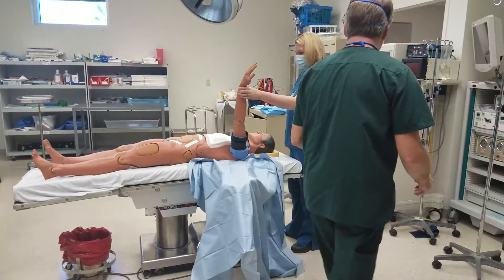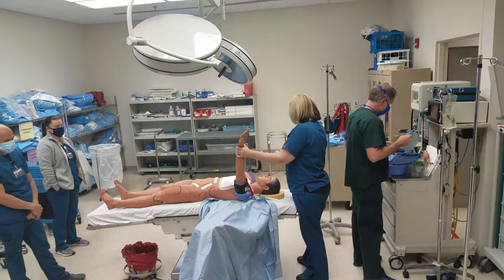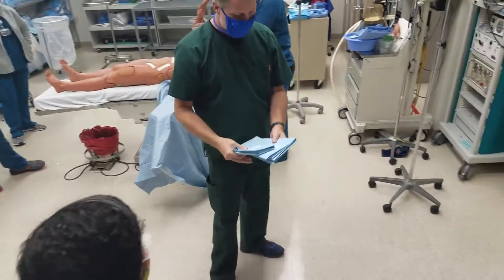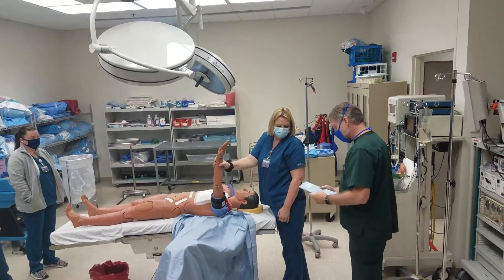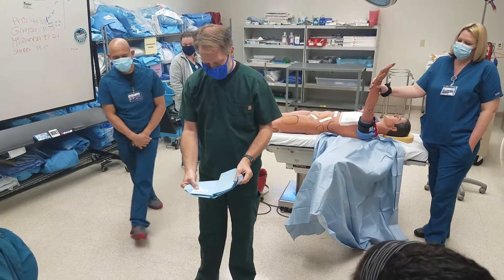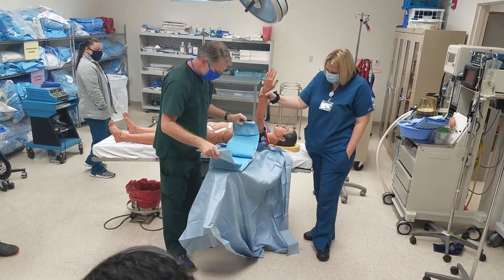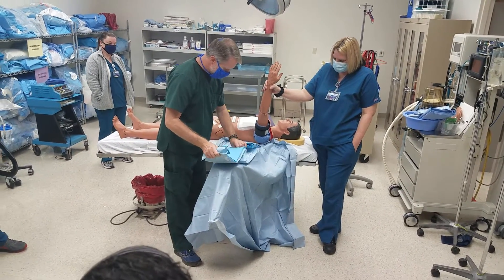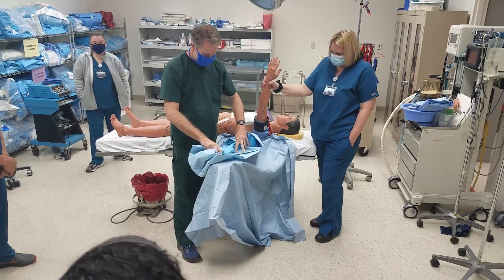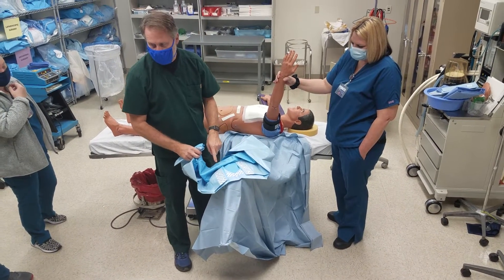It's a little bit difficult. Sometimes it's called a split sheet or split drape. It tries to tell you how to put it on. So there are the tails — here are those tails right there. Now this is all sterile, so I can use that as work surface at this point. I'm going to begin to see how this thing is oriented. You see the little cut-out right there? You can see the stickies. It would really be good to have a second person to help with it.